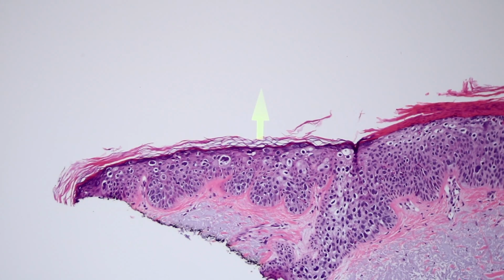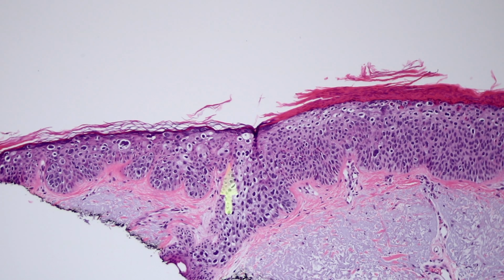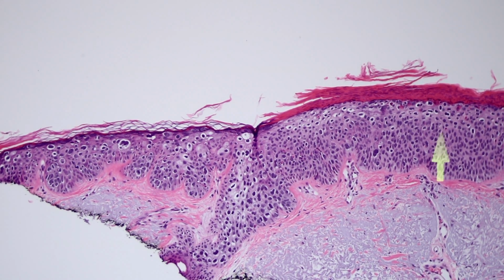This is a really nice clue for squamous cell carcinoma in situ: pagetoid spread. Atypical cells that are scattered and spread up into the epidermis and out away from the main tumor into the adjacent epidermis. So pagetoid spread is, to me, a really helpful clue to squamous cell carcinoma in situ. And again, you might say, well, melanomas have pagetoid spread, and so does Paget's disease of the nipple and of the genital area. How do I know it's not that? Well, melanoma and also Paget's disease almost never make full thickness confluent zones of atypical cells. They have lots of pagetoid cells that can sometimes almost fill up the epidermis, but I would say it's extremely rare to have just this solid block of atypical cells filling zones of the epidermis.